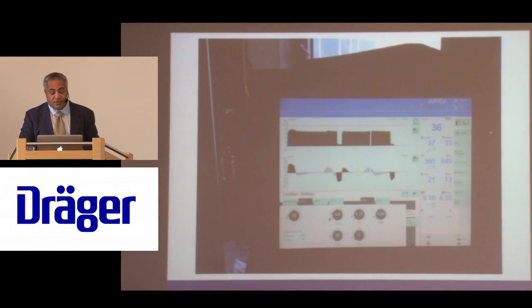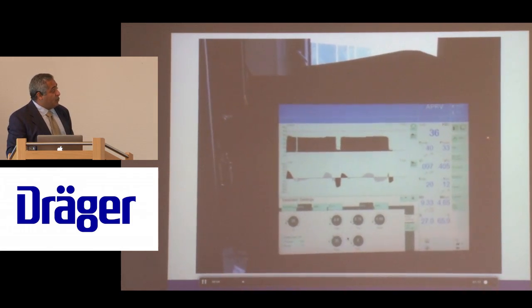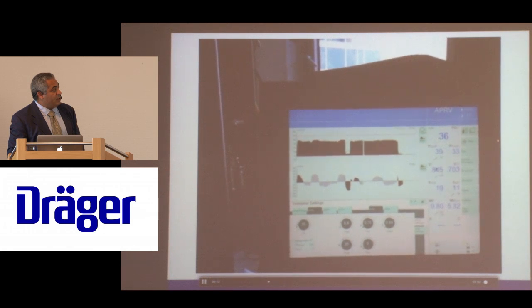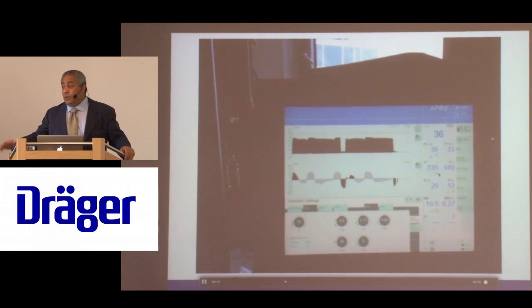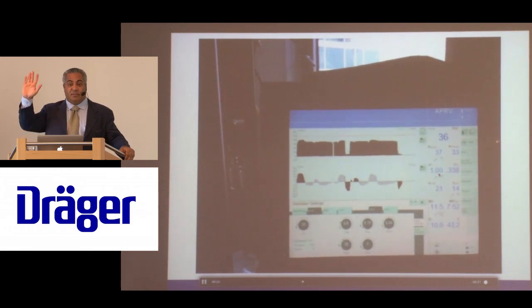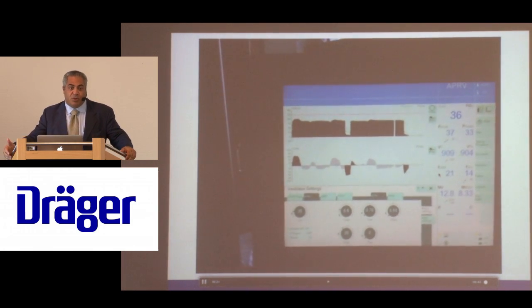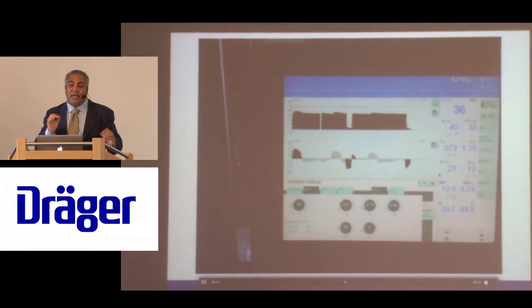Now, I just want to show you a patient. This is a patient of mine. And this patient is, the pressure is 35 centimeters. 35 centimeters. And if you look, this is a spontaneous breath here. The patient's tidal volumes are 800, 900 cc's. Now, I promise you, and we actually have a ventilator, right? So if there's any volunteers that want to be placed on 35, just raise your hand. But if I put anyone here, or even myself, on 35 centimeters of pressure, your diaphragm would be flipped, and you would not be able to move any volume at all.